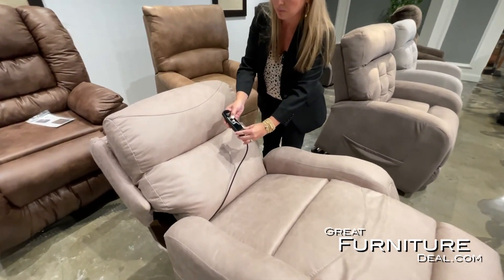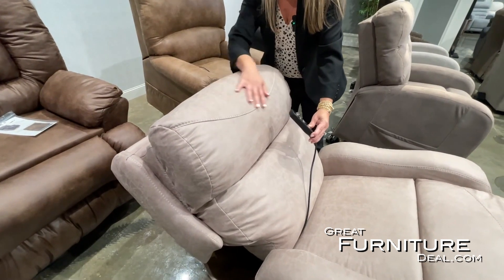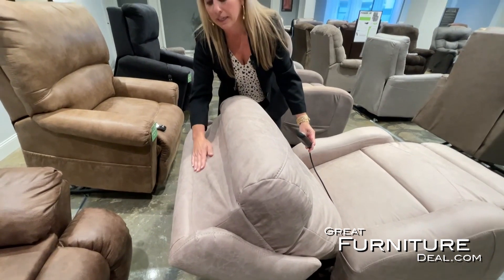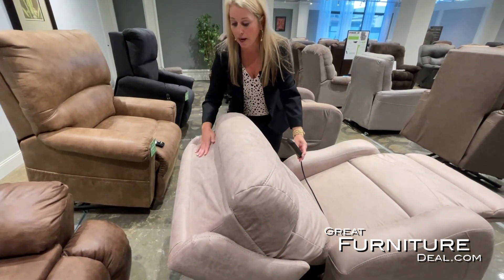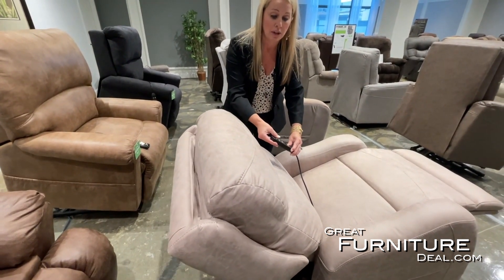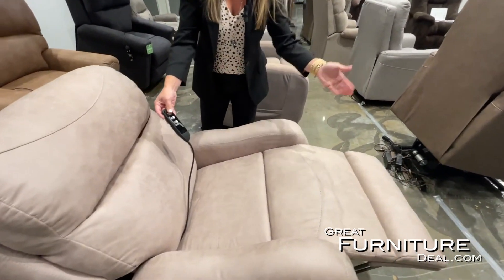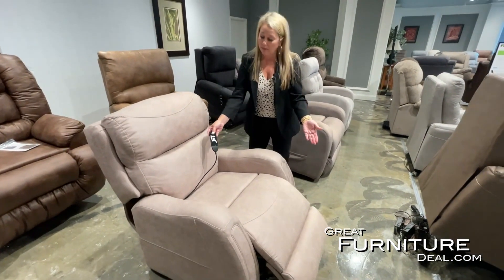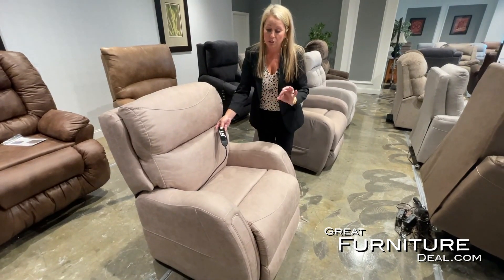This is what we call a three-way chair, so the back is going to lower and the feet will fully raise. This one has a power headrest, so it will bring the head into a TV-viewing position if they'd like. The mechanism is covered in the back with shrouds — there are no exposed wires or exposed mechanics. You can quietly close the chair, and as you do, you'll notice the feet and back close together in a unitized motion.